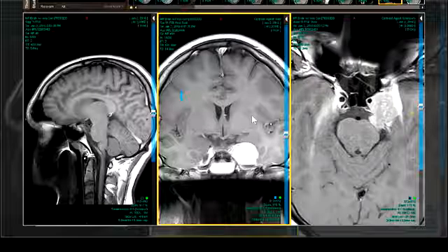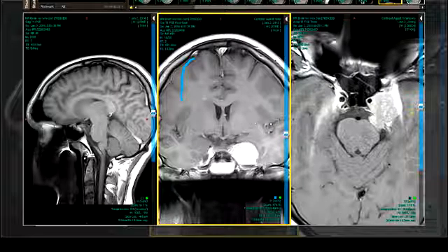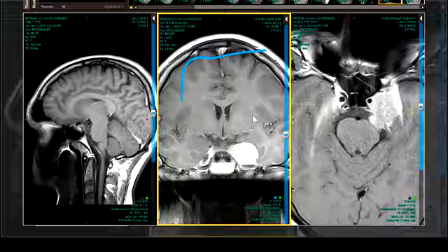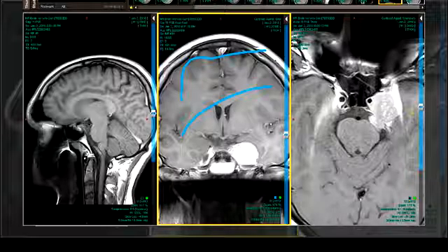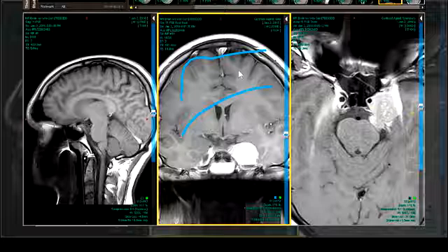Now, I wouldn't typically do a DCE MRI for this, but a meningioma would come up early, and then it would persist for a pretty long period of time and probably continue to rise like that, whereas the curve for a schwannoma is going to look more like that. So I think a cerebral blood flow analysis would probably be more distinctive, but I don't know, honestly, whether cerebral blood volume would help you in terms of differentiation. It's beyond my pay grade.